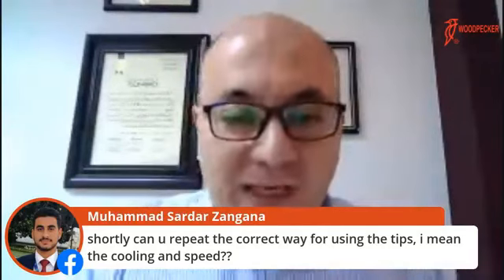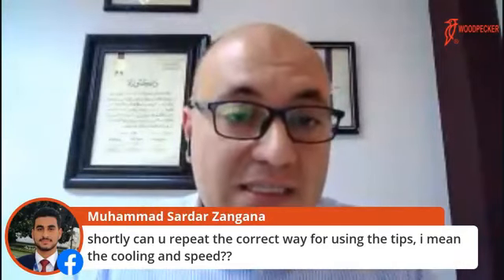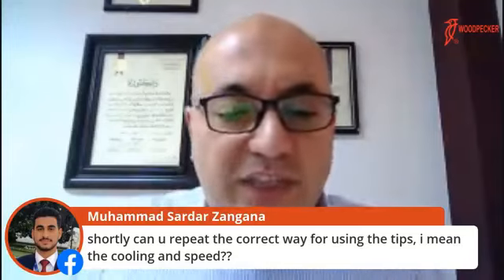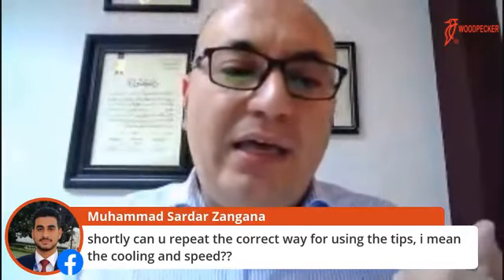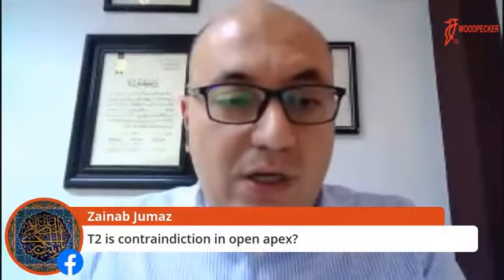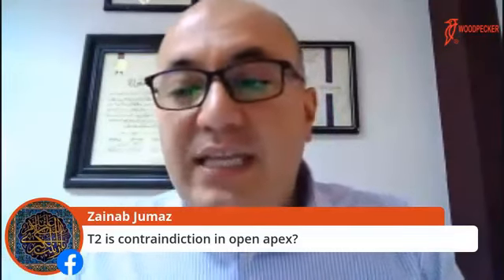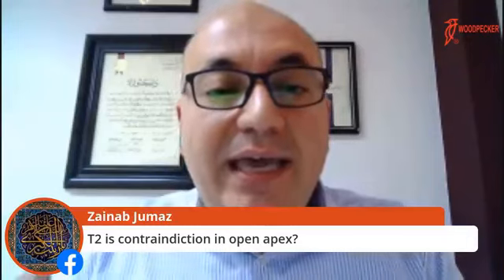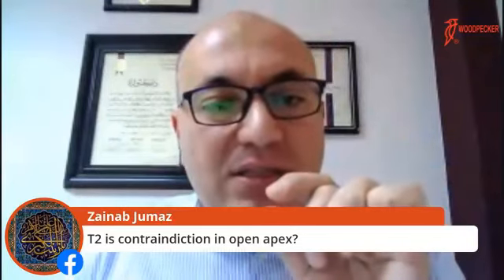But again, in a brief revision or summary, whenever you are using a smaller size, please follow the rule, because at the end of the day, maybe you will not keep it in mind. The rule is as follows: the smaller the tip, the less the power setting you have to use, and you increase gradually. And whenever you increase, please make the time pulses shorter. Very important. Minimize the time pulses if you increase the power to avoid the separation.